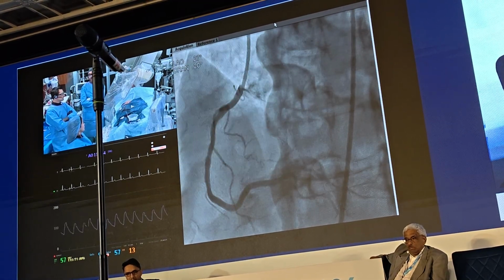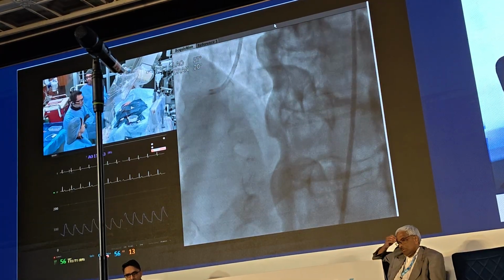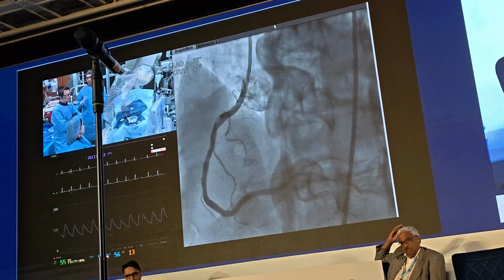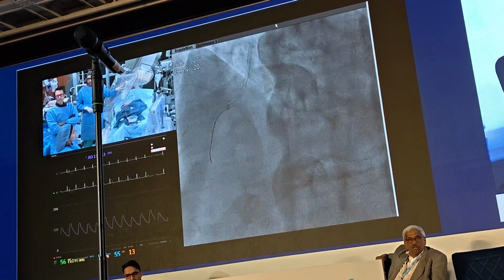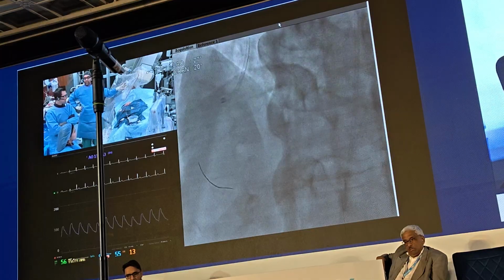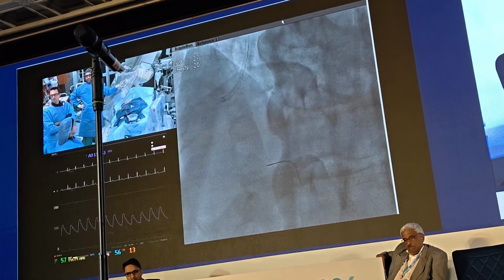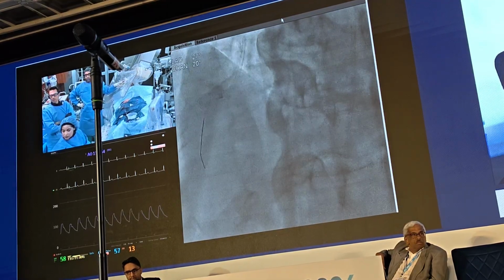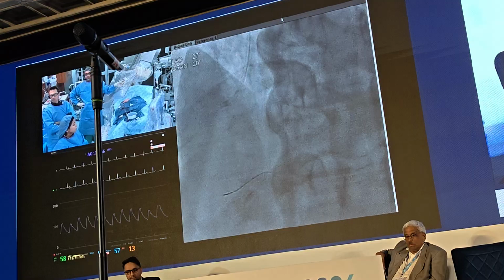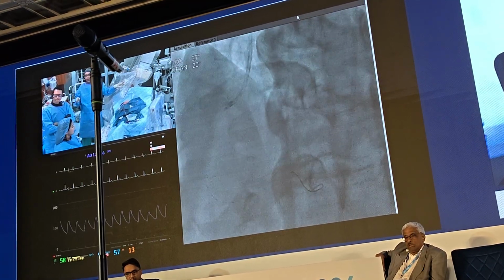So this is our only picture, all right? So this is setting up basically the blueprint of the house, and so this architecture is now going to guide us throughout the entire procedure. Okay, and so then what Evan is doing is now he's wiring these arteries based on this dynamic roadmap. And you'll notice something very important. You see at the end of the wire there's a loop, okay? He's purposely made that loop, and the reason is that loop makes sure that we don't exit the artery.